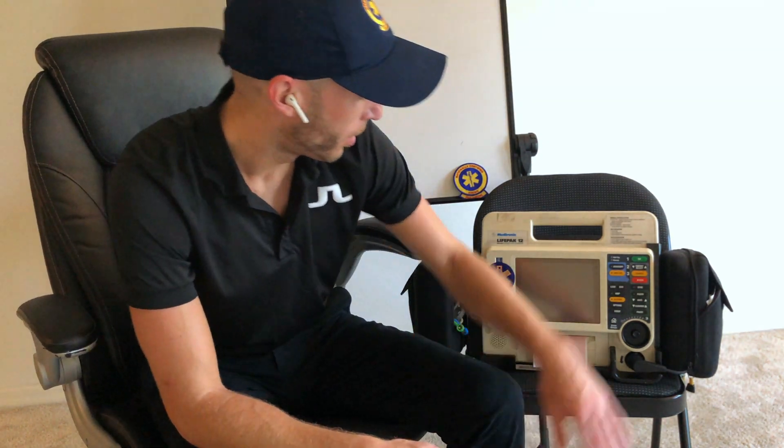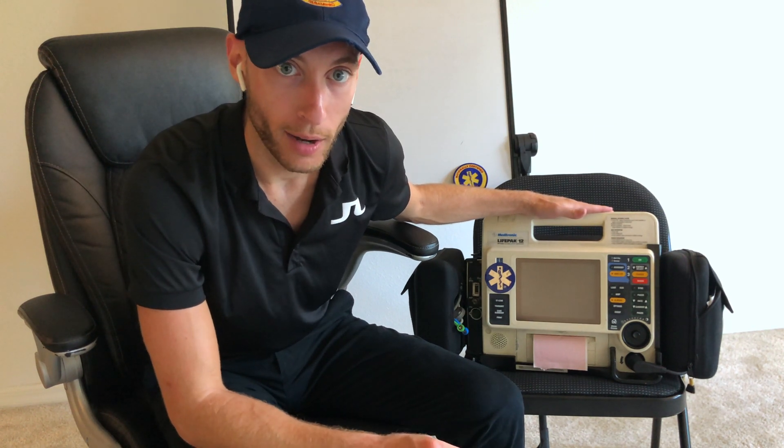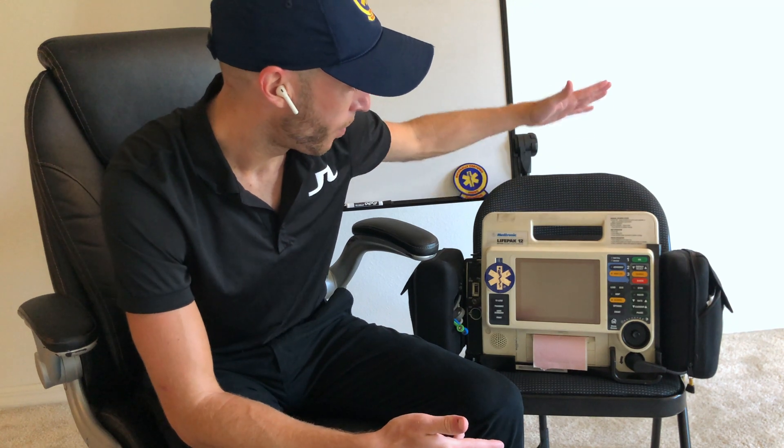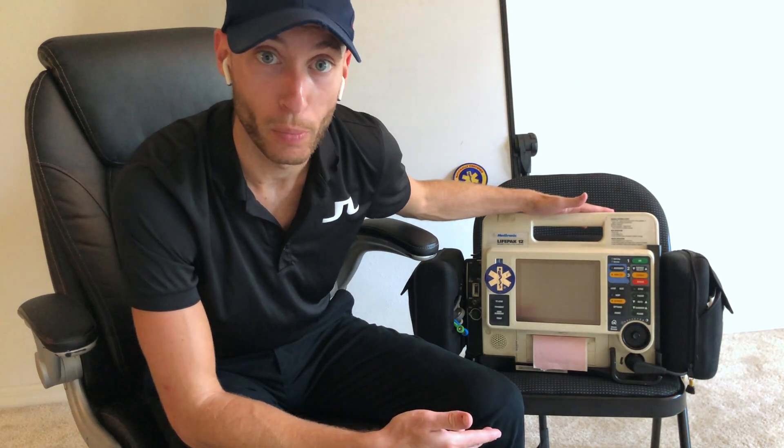Today we're talking about how to use a LifePack — how do you use a heart monitor. There's LifePack, there's Zoll, there's all kinds of monitors. Everywhere I've ever worked, I've used a LifePack. So we're going to talk about the LifePack, and I actually have my own LifePack 12 I just purchased here.